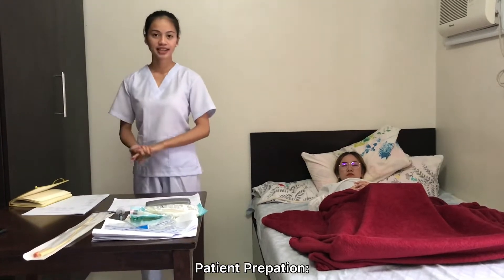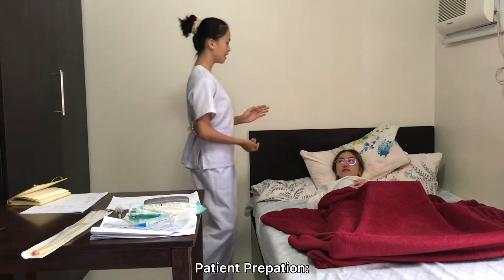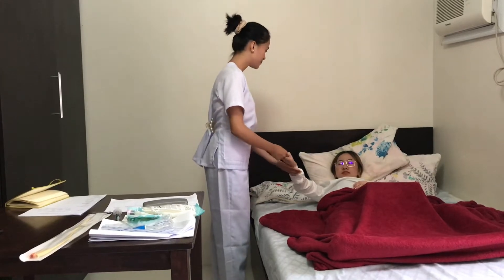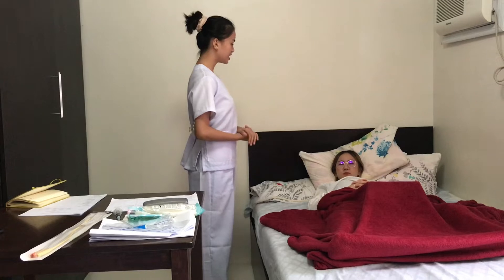The third step is to identify the patient and ask if she has an iodine allergy. So you are Ms. De La Cruz, ma'am? Yes. Do you have any iodine allergies, ma'am? No.